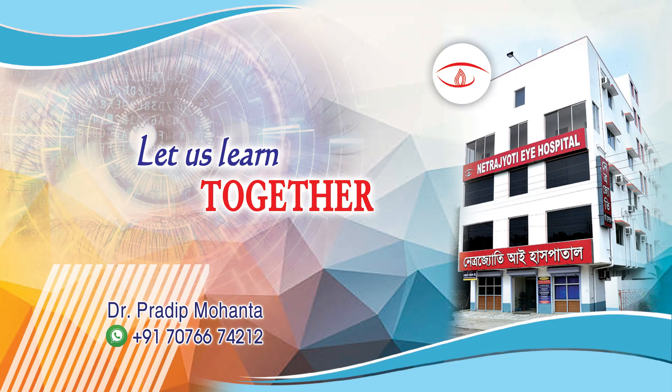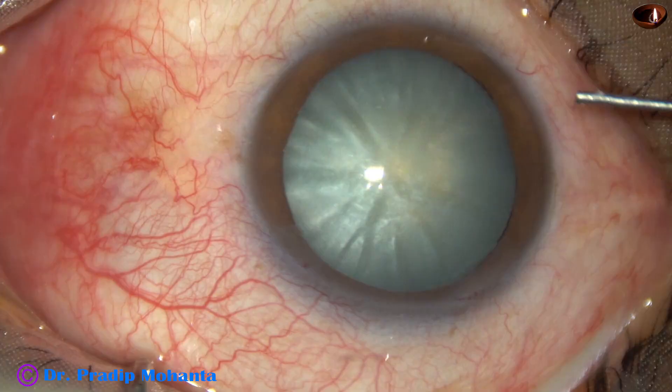Friends, welcome to my workplace at Ranaghat, West Bengal, India. Let us watch management of this intumescent cataract.